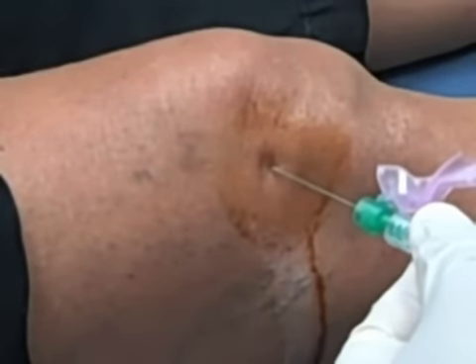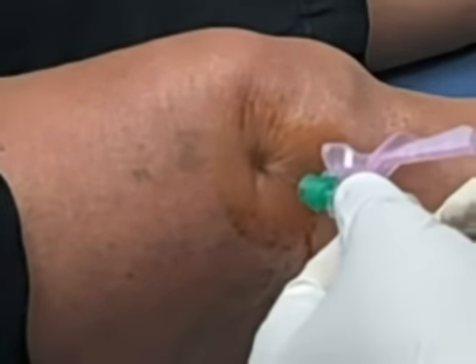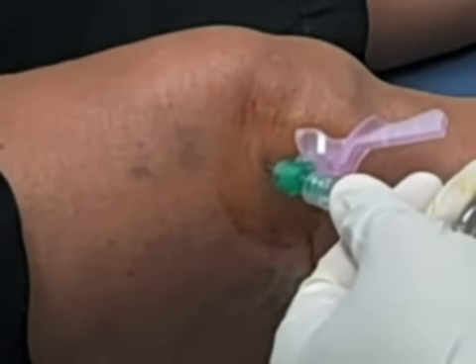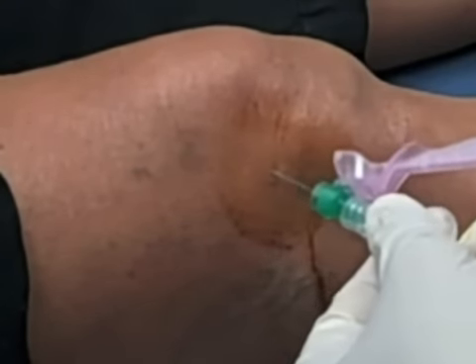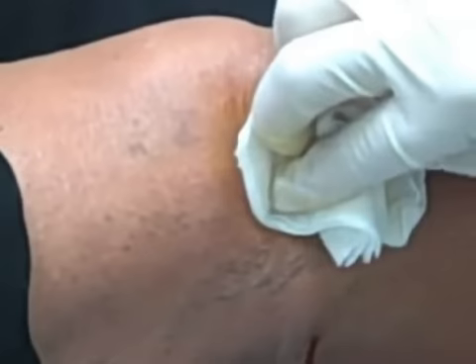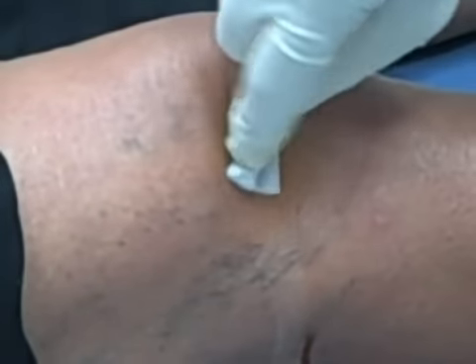Keeping the needle perpendicular, we'll advance it slowly and inject the medication. Again, if you encounter resistance while advancing a needle or injecting medication, reposition slightly until it flows smoothly. Again, clean off the skin from excess betadine and apply a Band-Aid.